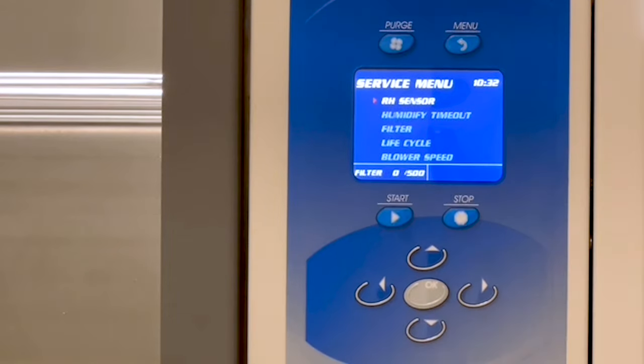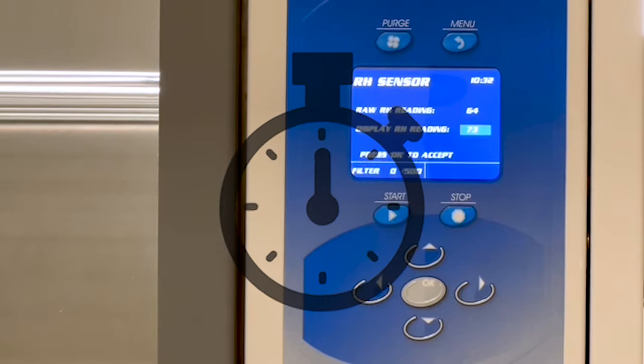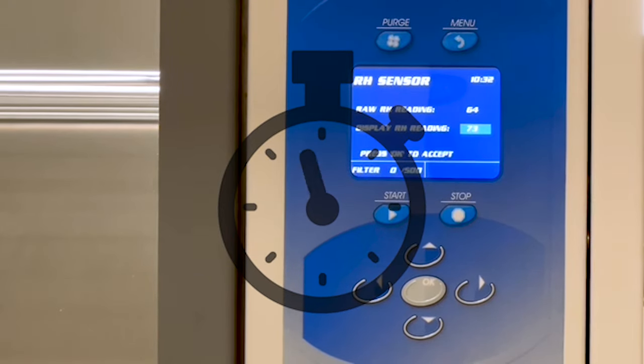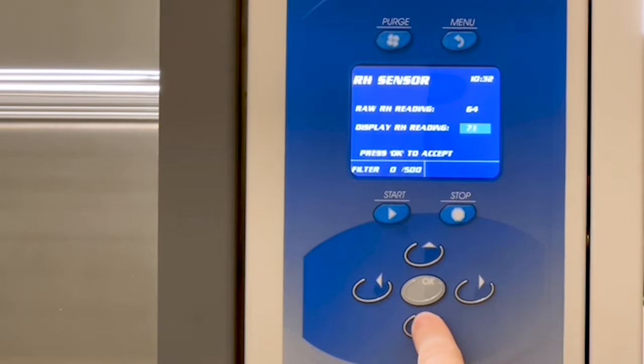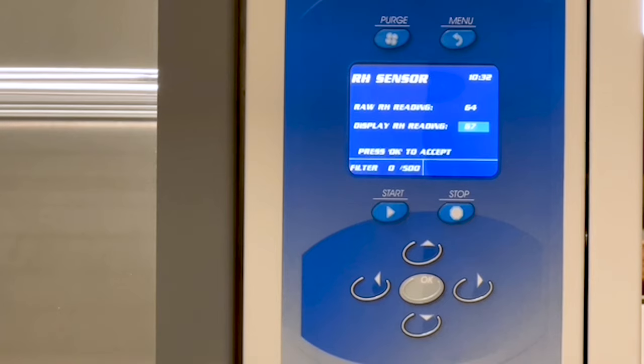In the Service menu, select RH Sensor and press OK. Wait one minute before changing the display RH reading to the corrected value from the hygrometer, and press OK.